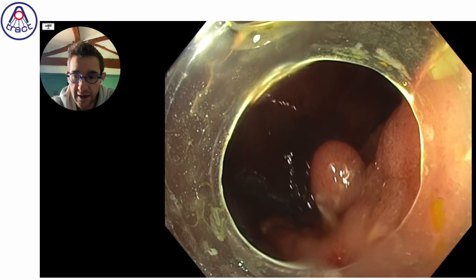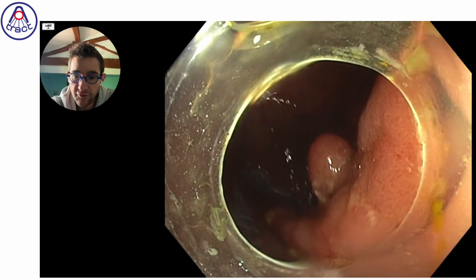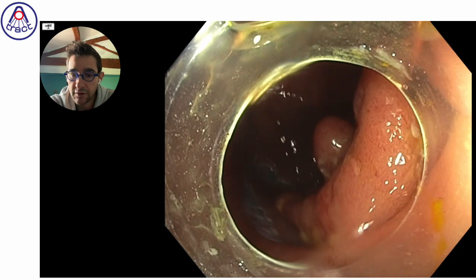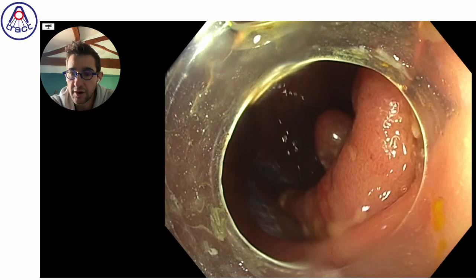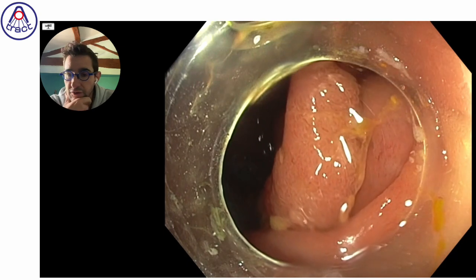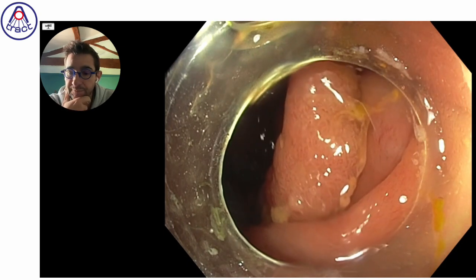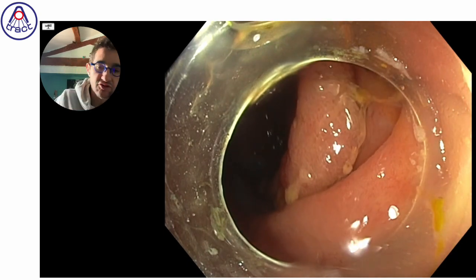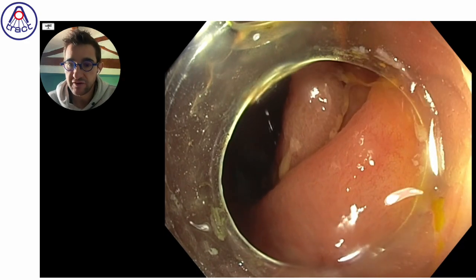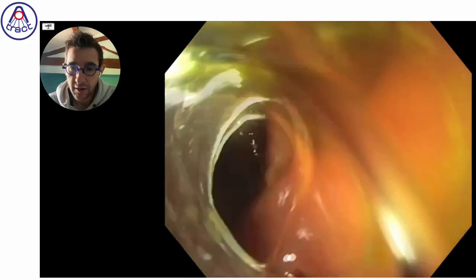Therefore I have chosen a strategy of 3-point multipolar traction, one on the left side, one on the right side close to the valvula, and one on the anal edge, that makes the resection relatively good once the traction system is in place.